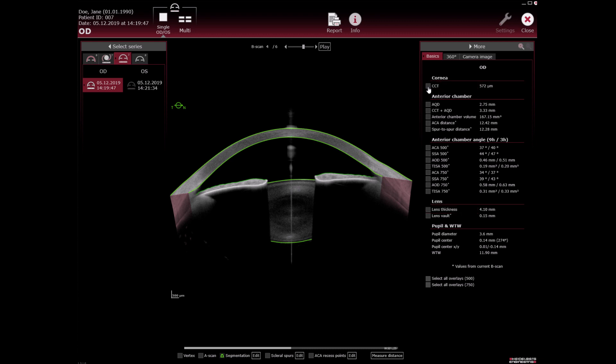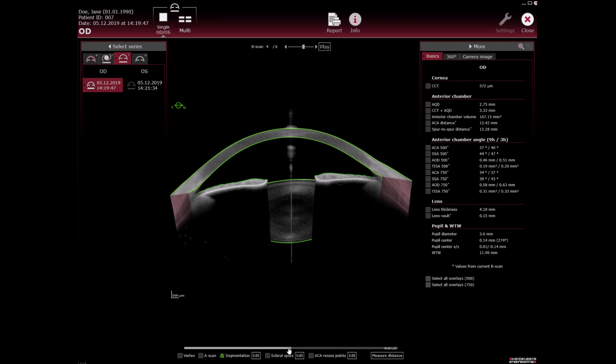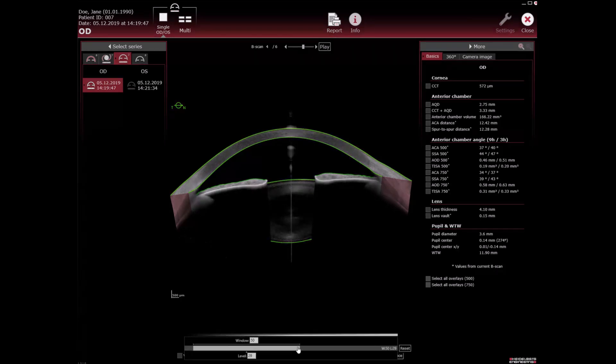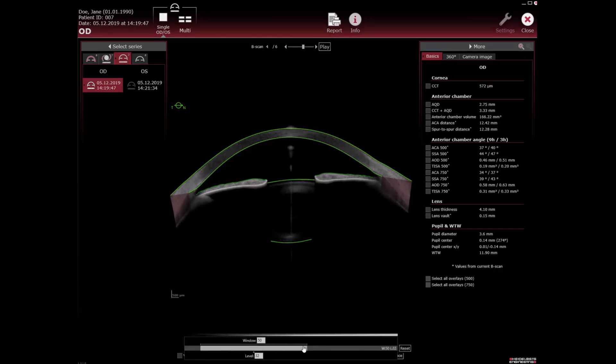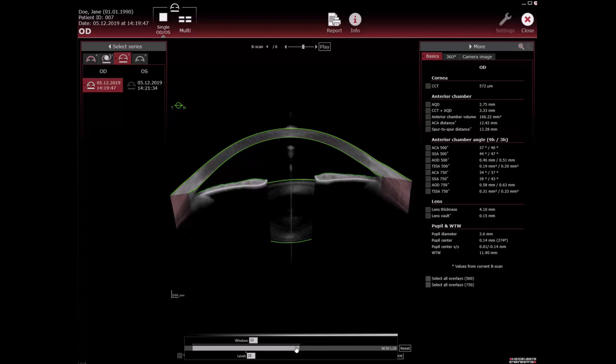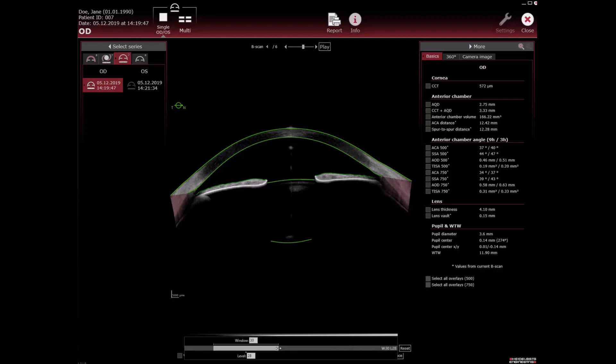To adjust the image brightness and contrast you can press alt on the keyboard or the slider below the OCT section image. Drag and drop the slider to the desired position and increase or decrease the image brightness and contrast. Window level is shown and can be entered to receive similar image properties when comparing different series with adjusted window level.